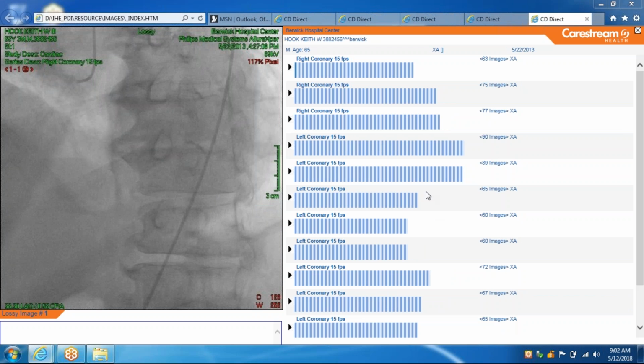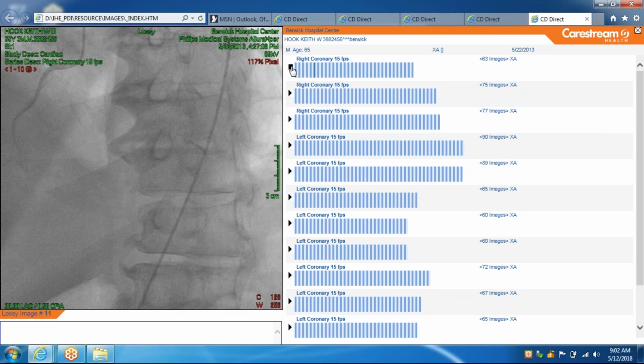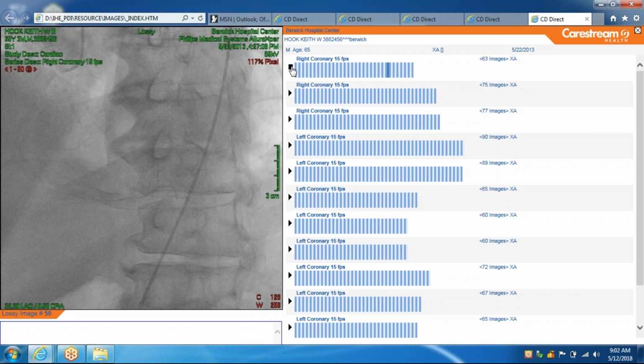Again, same protocol. Look at the right side of the heart. Catheter in the right coronary artery, inject. See this vessel is not very smooth, a little bit lumpy, bumpy, but I don't see any significant lesion there. So let's look again.